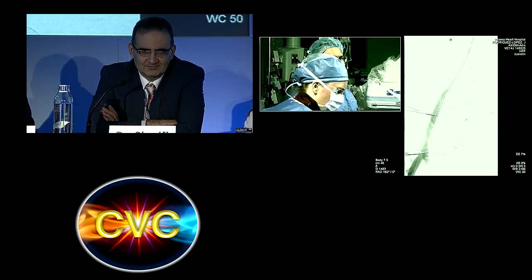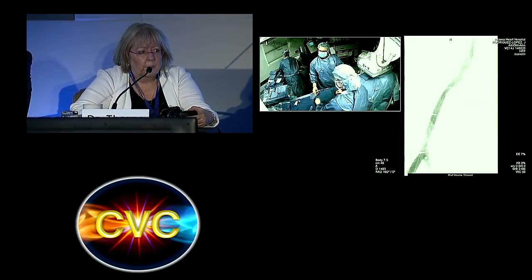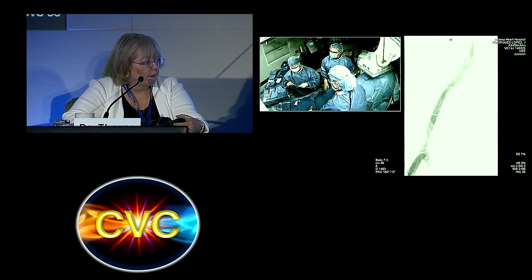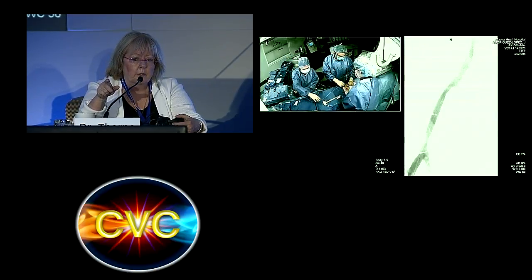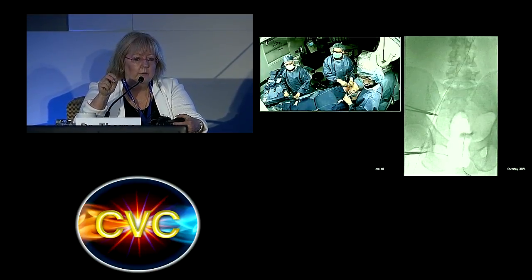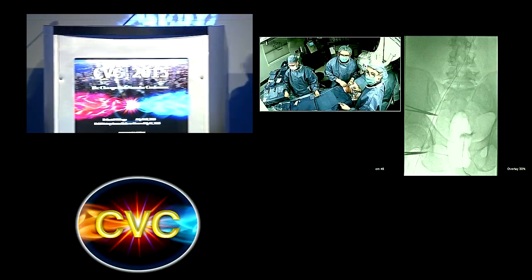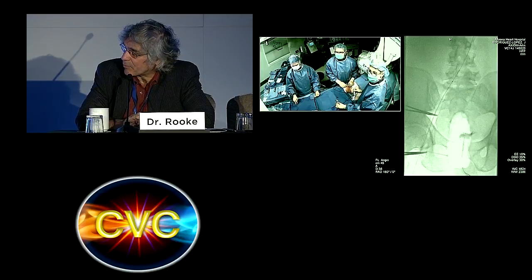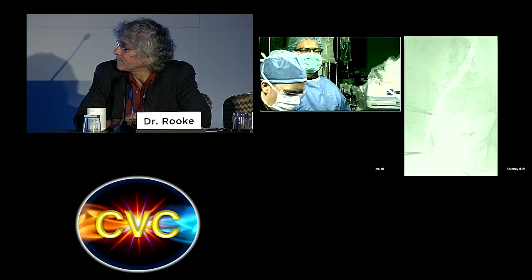Patty, if you're concerned, do you ever measure a pressure gradient across it? You know, the pressure gradient, we don't do it very often because it's such a small change. It could be a 2 millimeter pressure gradient, and that could be significant in a vein. What I'm going by is the fact that the contrast is hanging up right at that level. And I know there's a caliber change, but it should go faster through a narrowing than a wide spot. Right. I'm always surprised that when you see something like that visually, even though the vein doesn't look that narrow, how often we may get back a 3 or 4 millimeter gradient across that, which clearly would be significant in a setting like this. In a vein, that is significant.